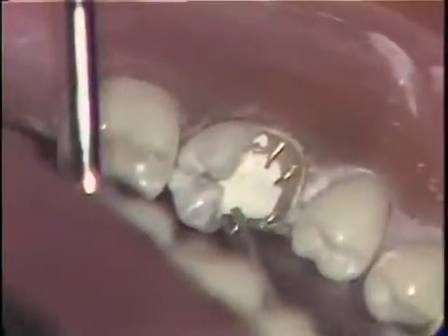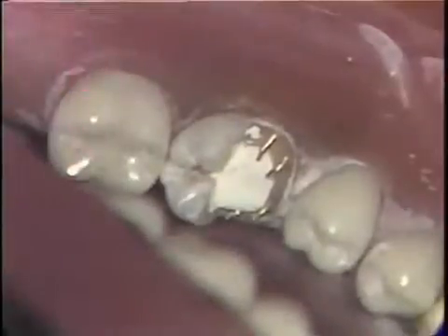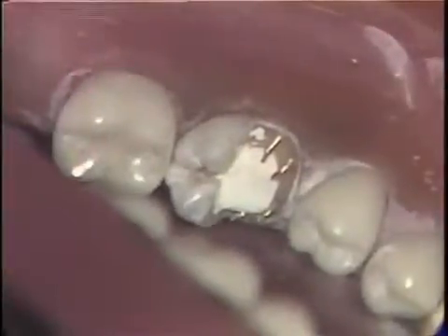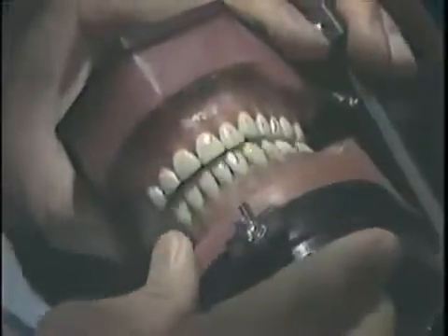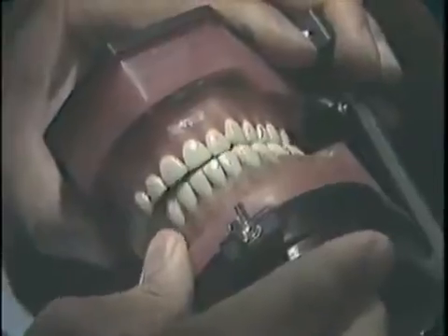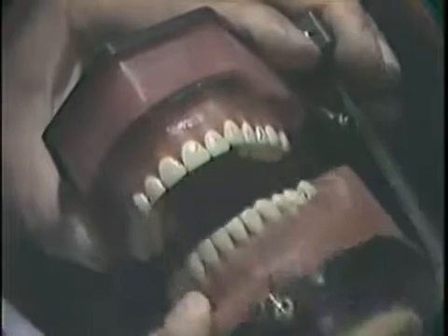This bending tool lets you bend in a number of directions. The occlusion is now checked to make sure that the pins do not hit the opposing tooth in centric occlusion, centric relation, or working or balancing movements.